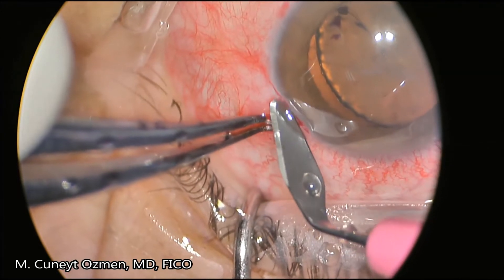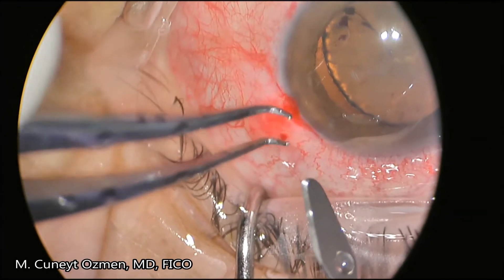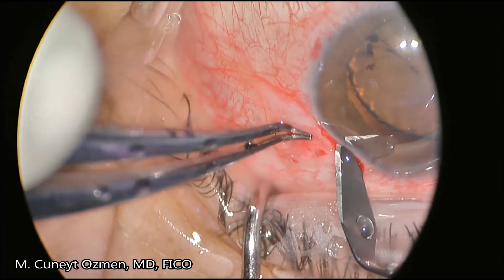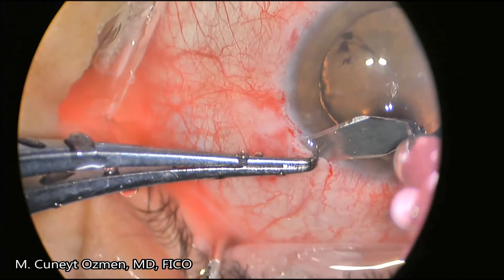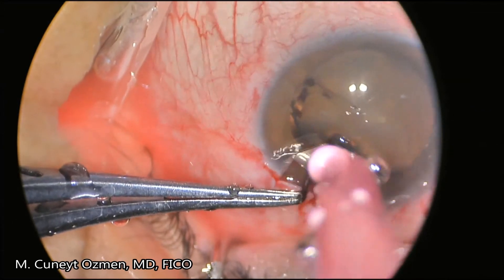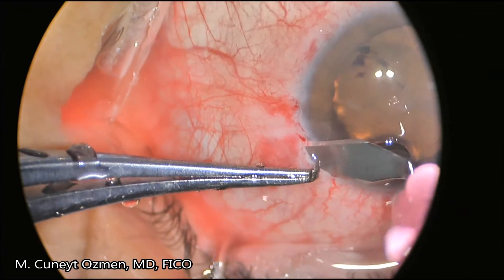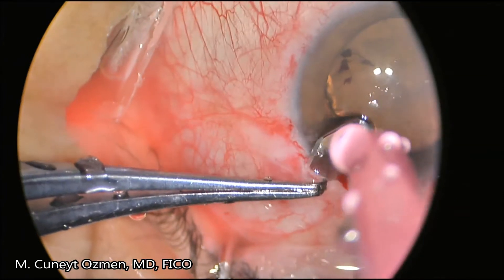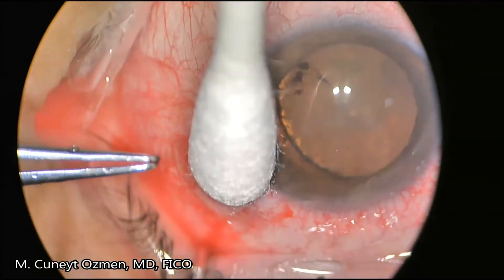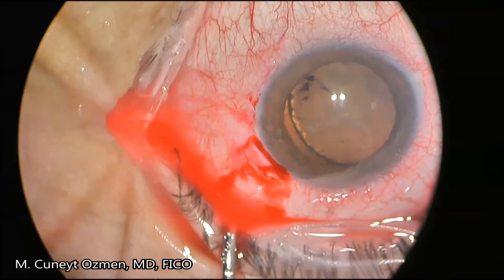I start the surgery by creating a Hoffman pocket at the center of this dialysis. The important thing with the Hoffman pocket is you need to be cautious not to be too deep, otherwise you will lose your suture, but you also don't want to be too superficial so that your suture will erode the superficial sclera and conjunctiva on top of it. Ideally the depth of the Hoffman pocket should be around one-third of the scleral thickness, or around 250 to 300 microns.